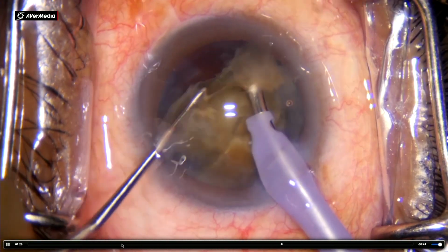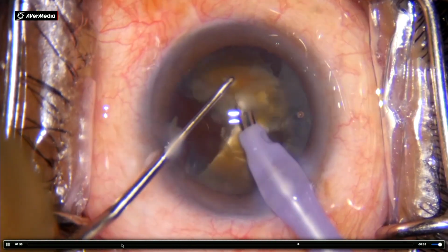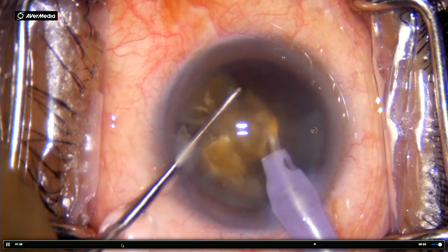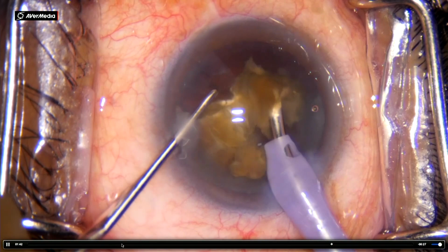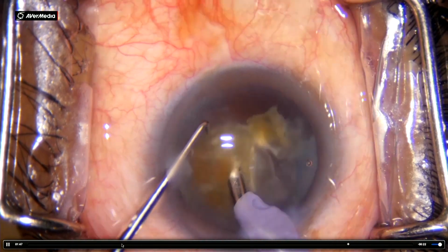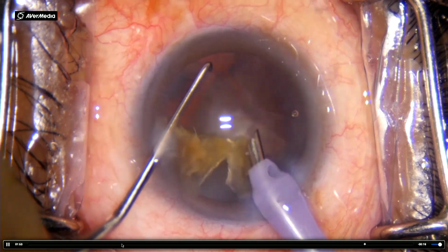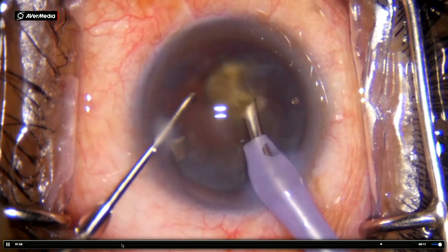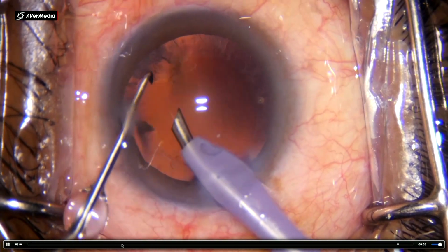So here again you can notice, you go into the nucleus, hold it well steadily, chop with the sharp chopper on the side, and separate fully, and the piece is free now, and emulsify it in the center. Here again, when your phaco time is on and the machine is going on for some time, use dispersive viscoelastic. You need not use Viscoat, very costly ones. You can use Indian versions which are similar to this and which work very well, or even HPMC at times, but then repeat: stop phaco, add more, so that it doesn't injure your endothelium, because your corneal clarity is the one which is most important on day one.